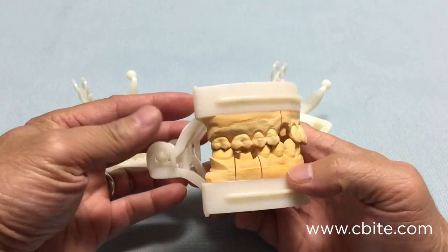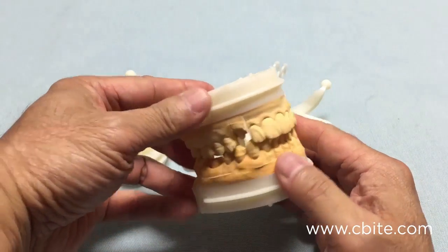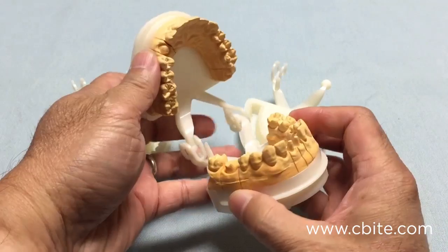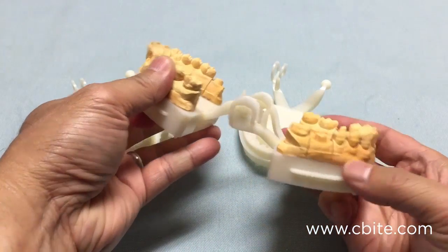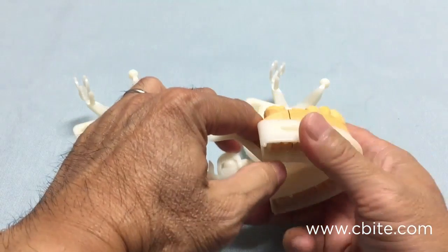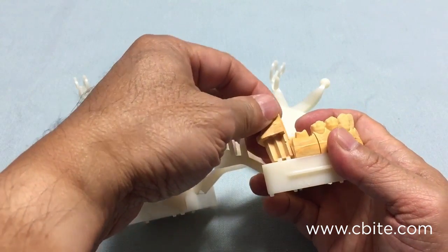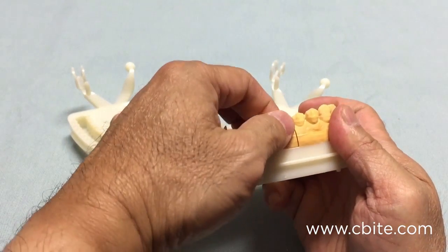As you can see, this is a full mouth model and there are many sections, many units to it, both lower and upper. This is a very stable system, and once the dies are seated in place there is just no room for movement.